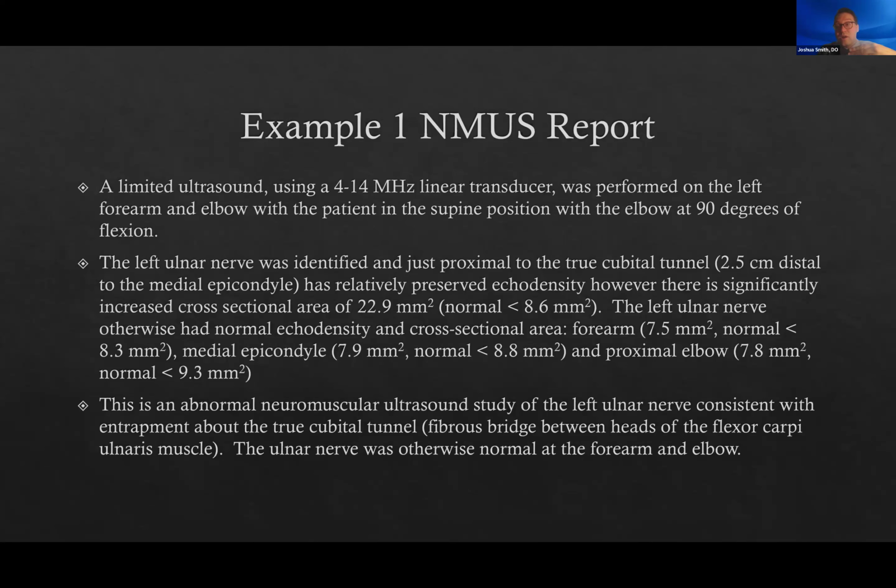And then in the summary, I would have these two first-sentence lines right under the summary. So you have your summary of your nerve conduction and your needle findings, and then I would have the neuromuscular ultrasound summary, this blurb. Some people like to provide the values in a table format. It just depends on what your lab likes to use. We're moving towards the table format just to get everybody on the same page with the reporting, but it depends if it's you in a group or if it's just you practicing.